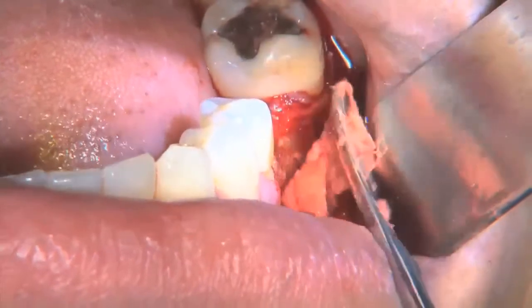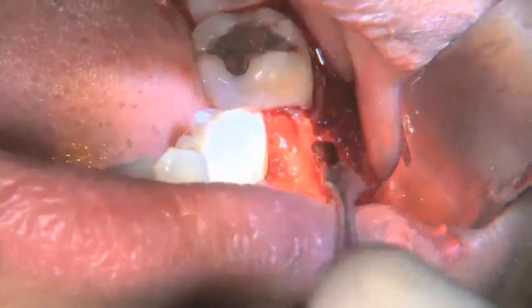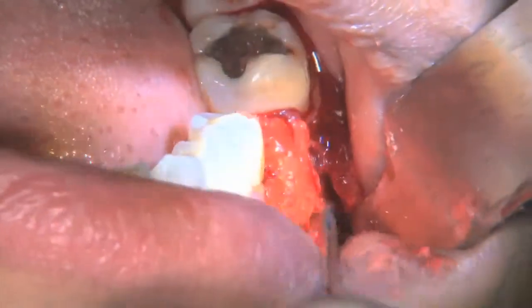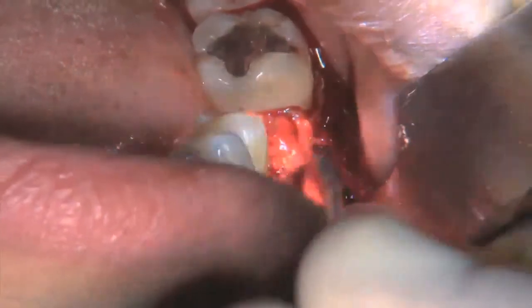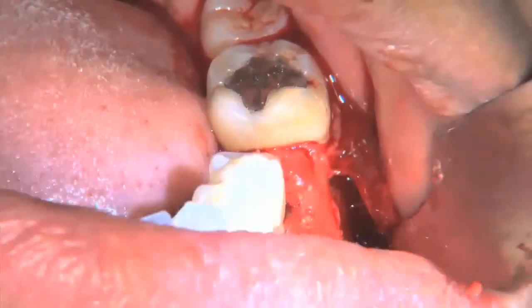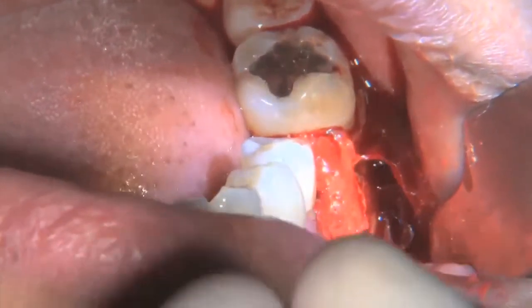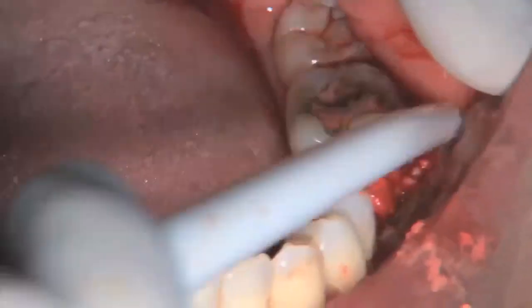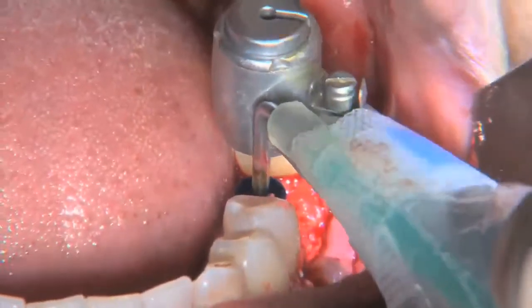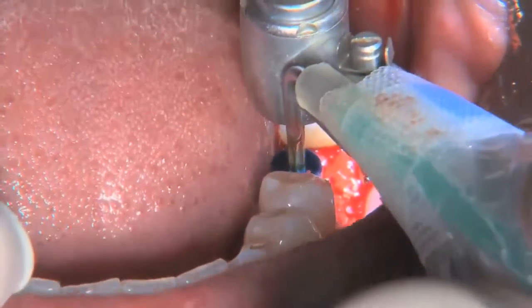After placing the freeze-dried demineralized bone putty, we then use the sandwich technique and place the calcium sulfate/HTR/PRP mix over the bone putty. With the calcium sulfate in the mix, it will gradually harden and become a protective barrier against fibroblast ingrowth into the bone graft material. A contoured healing abutment, in this case 3 millimeters in height by 5 millimeters in width, is placed. This serves the purpose of forming the emergence profile during healing.